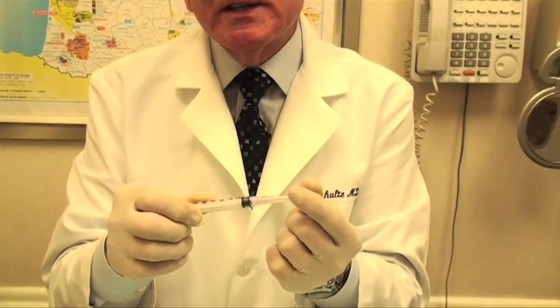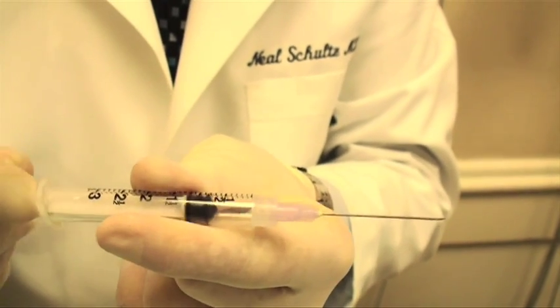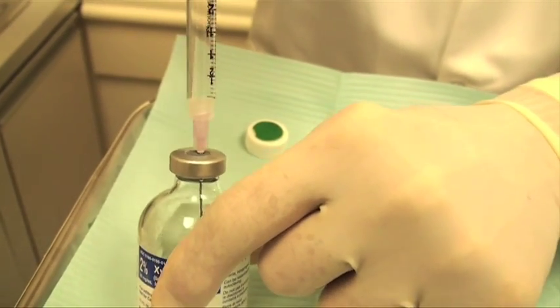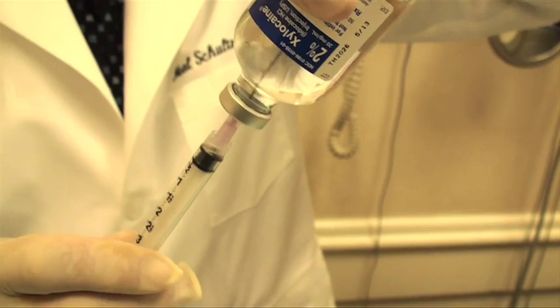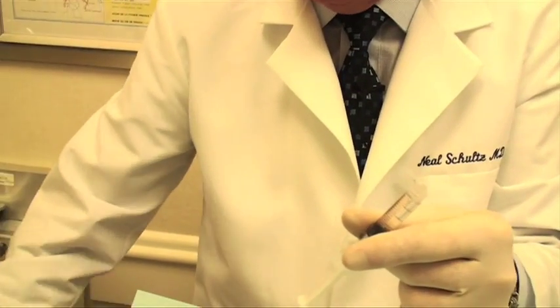Take a syringe — these things have all been opened but they all come sterilized. If I take the top off the syringe and I pull back on the plunger, I can bring air in, and then I take the needle, I put the needle on the top of the anesthesia and I push the air into the bottle. I then turn it over and you'll be able to see the anesthesia coming into the syringe, but this needle is much too large to be used to put the anesthesia into the patient, so we take a very tiny needle.